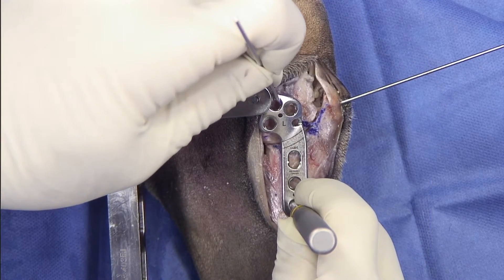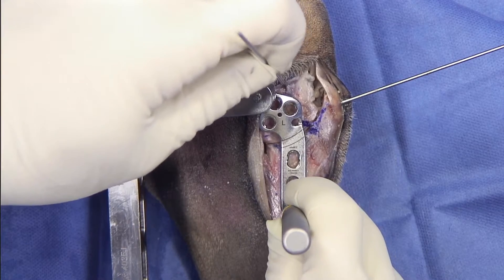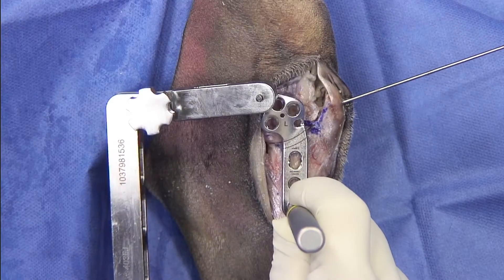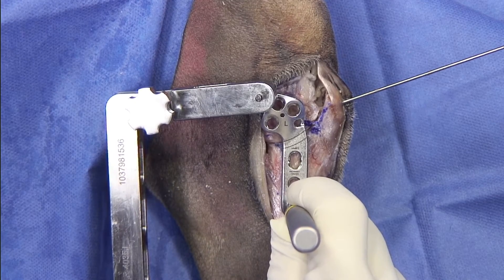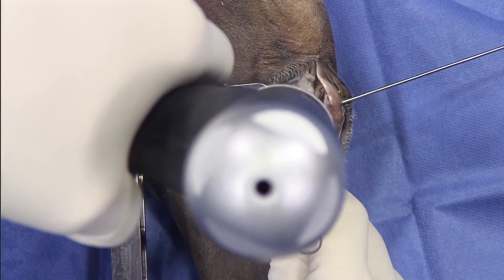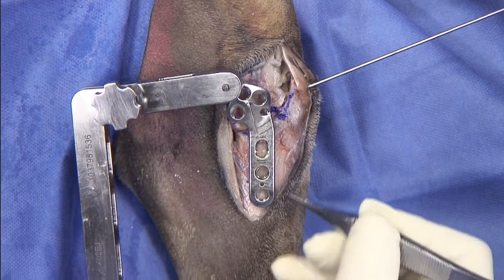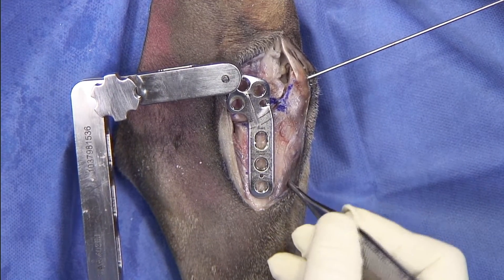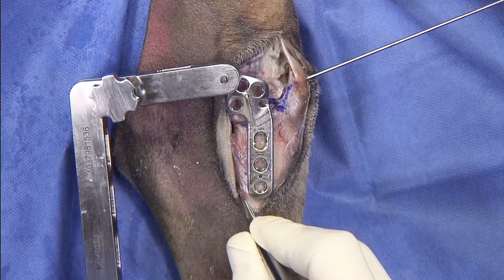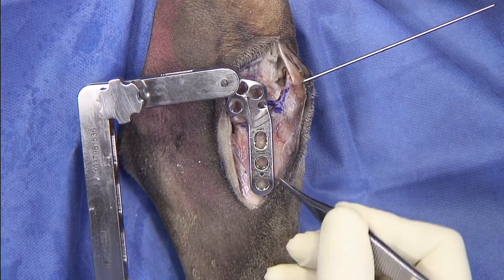Carefully check that this screw is not too cranial. I have good bone here and that the proximal screw is not too close to the joint. If you're happy, you go ahead and fix the plate. I usually like to have an assistant doing it, and it's important when I fix it distally to fix the plate in the center of the bone. Remember that the shape of this plate allows optimizing the position both proximally and distally.